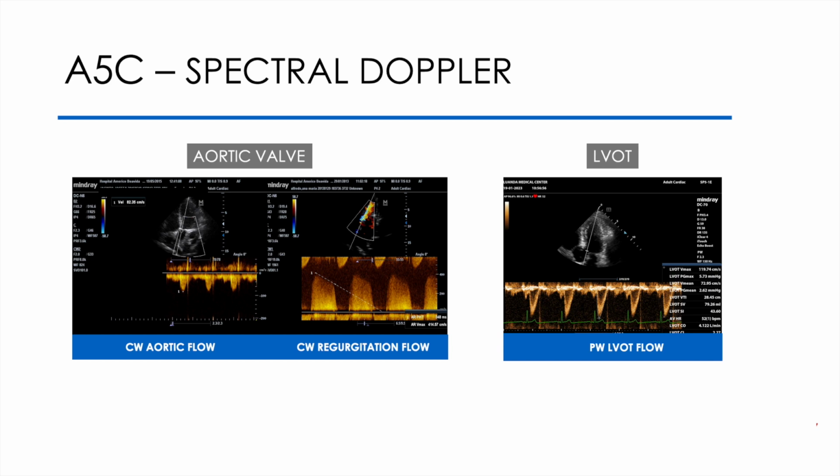Normally, we have to increase the speed scale so that the peak of diastolic flow is clearly visible, and I then obtain a positive curve with a deceleration ramp that is slower the less severe the regurgitation. I must calculate the deceleration ramp, which allows me to quantify the regurgitation.